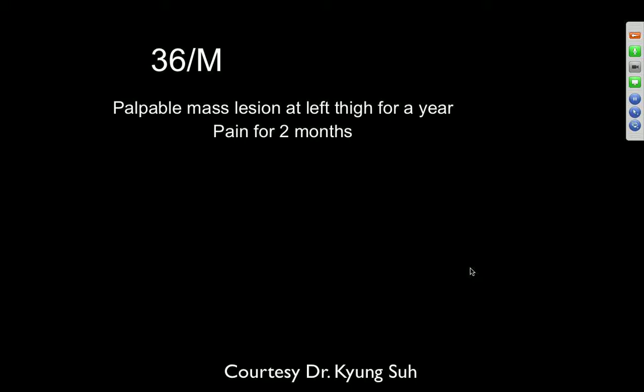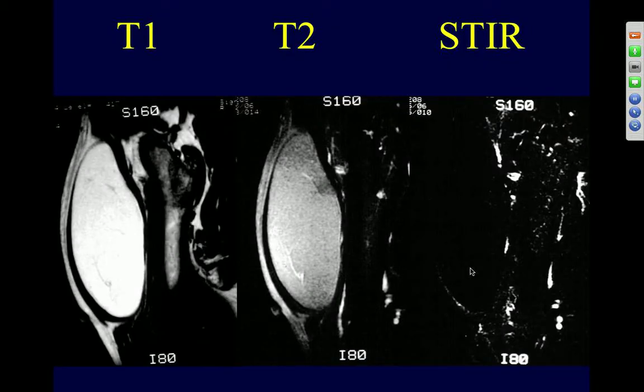So this is a lipoma. Let me see. I don't know if I have a slide here in a minute, but we will later. What you look for to see it's benign: benign lipomas can have septa in them, especially as we'll see in some examples. If it grows around a neurovascular bundle, it can come back and grow back to itself, and you can see the neurovascular bundle in the middle, and you'll get a thin septa where the two capsules of the lipoma coalesce with one another. But those septa should never be more than 2 millimeters in thickness. And they should be nice and smooth with uniform thickness. You should not have any nodularity to it.